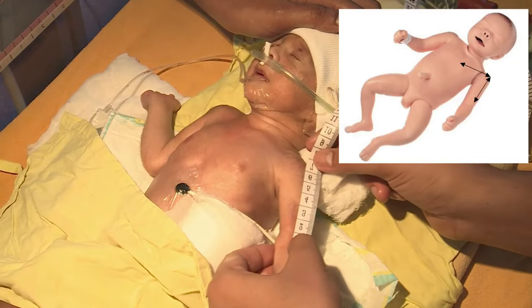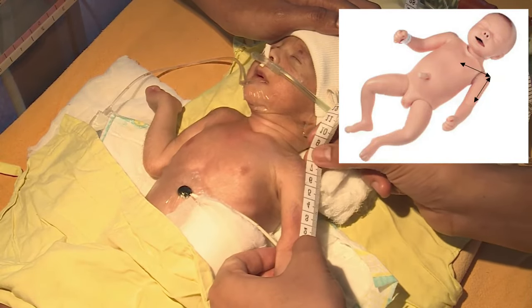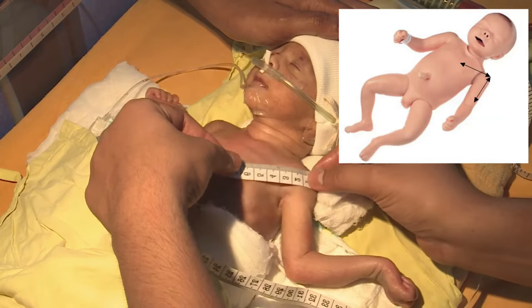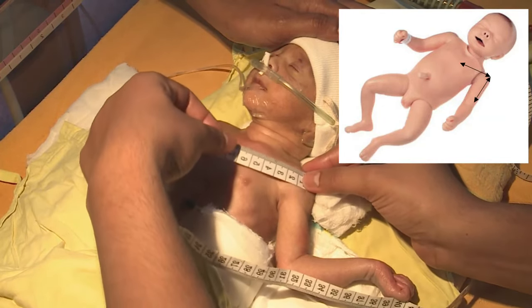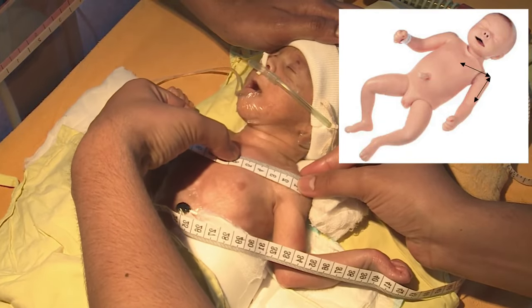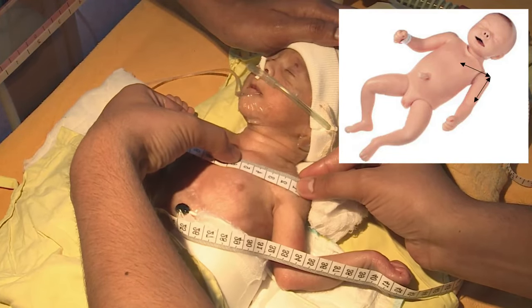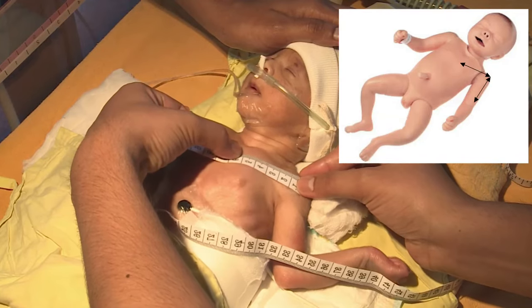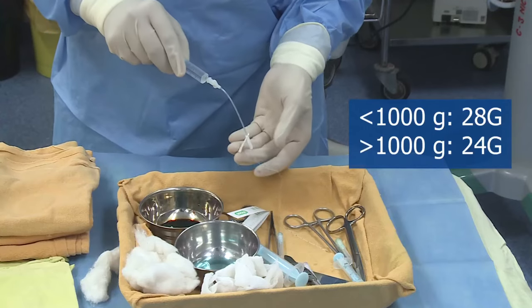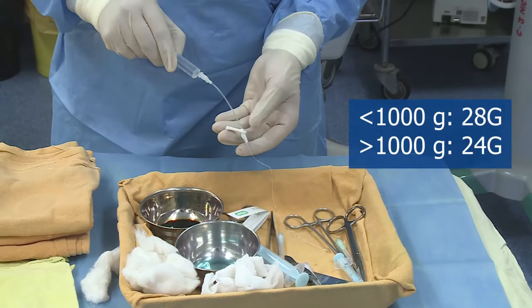Veins in the antecubital fossa are preferred for PICC line in an infant. Using a measuring tape, measure the distance from the planned site of prick to the acromion process, and then from the acromion to the second intercostal space just lateral to the sternal angle. This measurement approximates the appropriate location of the tip at the junction of the superior vena cava and the right atrium.